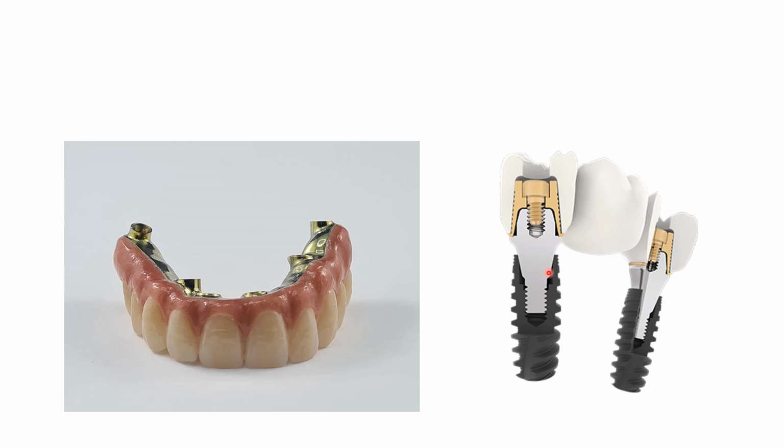Okay, and this is a multi-unit which goes into the implant, and on top of the multi-unit we have the suprastructure on which the restoration or the implant full arch bridge is fixed onto it. So this is the prosthetic screw, and inside the multi-unit this is the abutment screw. Okay, so this is something maybe confusing at this moment for you guys.